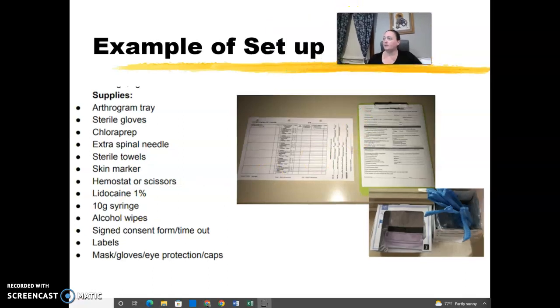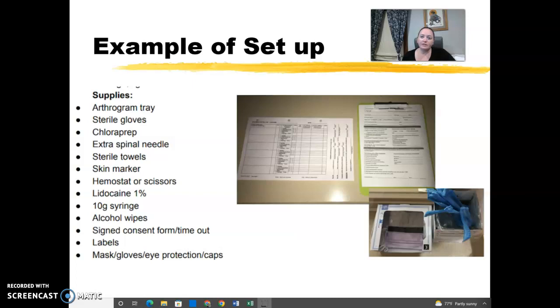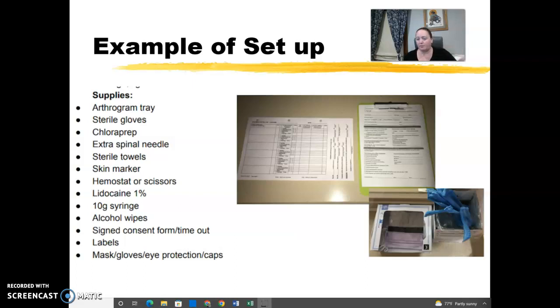Here are some setup examples for our location. Each tray will have a label on it — the arthrogram tray label is right on top. You'll have sterile gloves on the side; ask for the radiologist's size if you don't know it. We now use chloroprep instead of betadine, though that may vary by department. The tray also includes spinal needles, sterile towels, a skin marker, a hemostat for labeling the part, lidocaine, syringes, and alcohol wipes. There is also a timeout form example and a lab slip form.